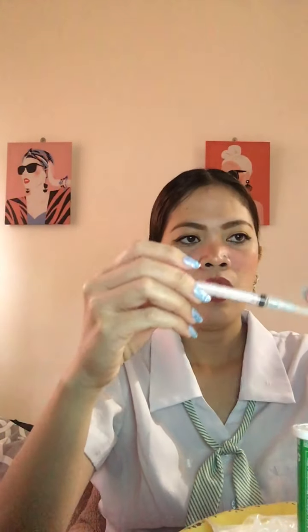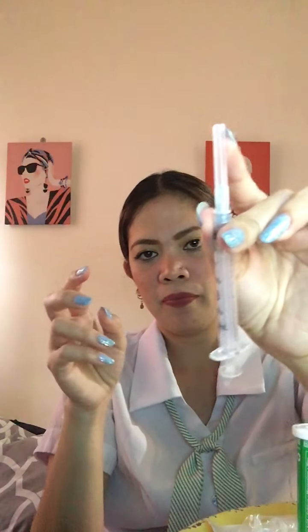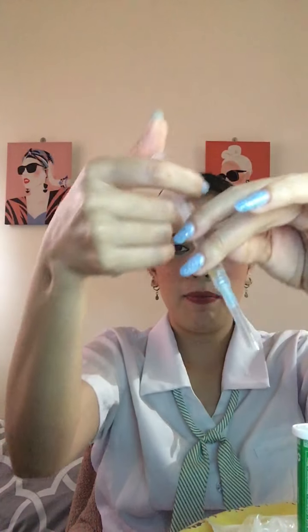So for the syringes, it has three basic parts. So this is the syringe: the tip, the barrel, and the plunger. Then the most commonly used types are the hypodermic syringe, insulin syringe, and the tuberculin syringe. Now the hypodermic syringe comes in 2, 2.5, 3 and 5 ml sizes.